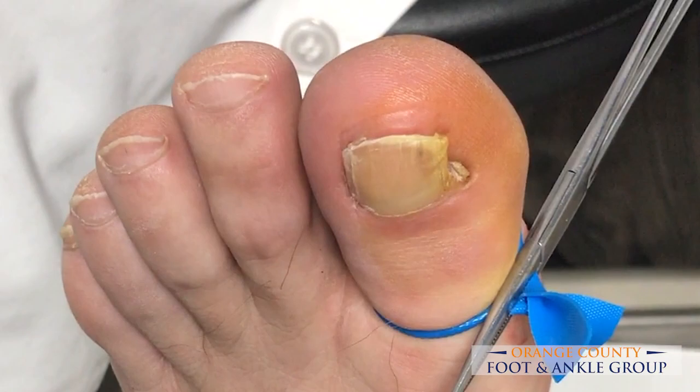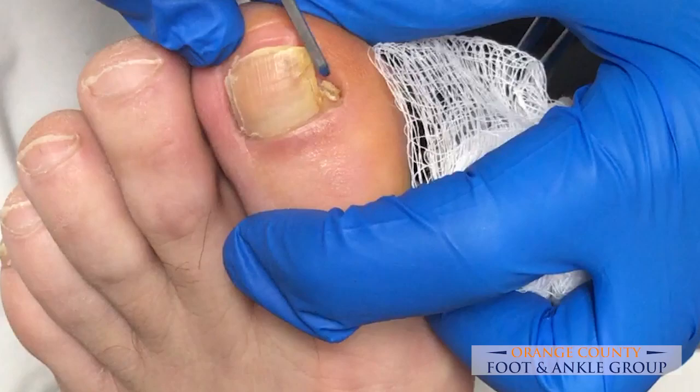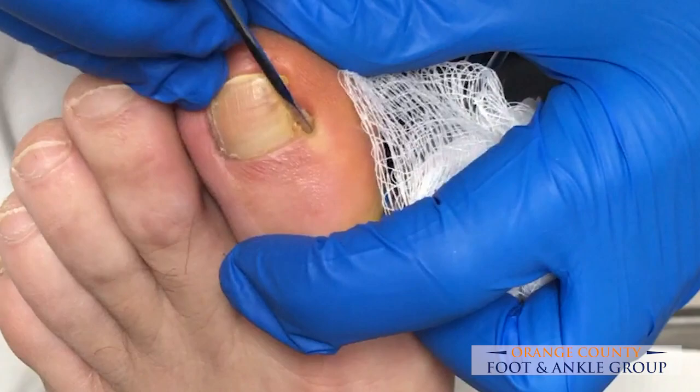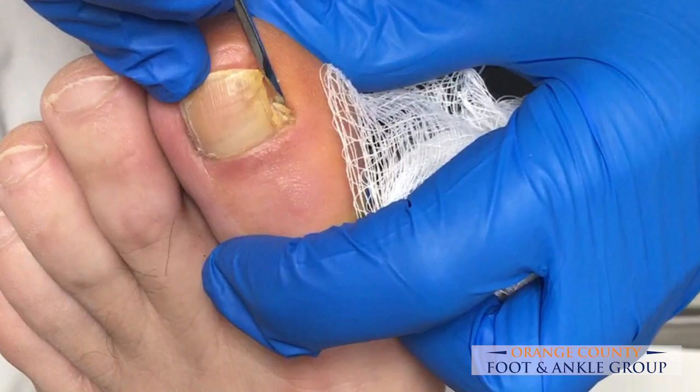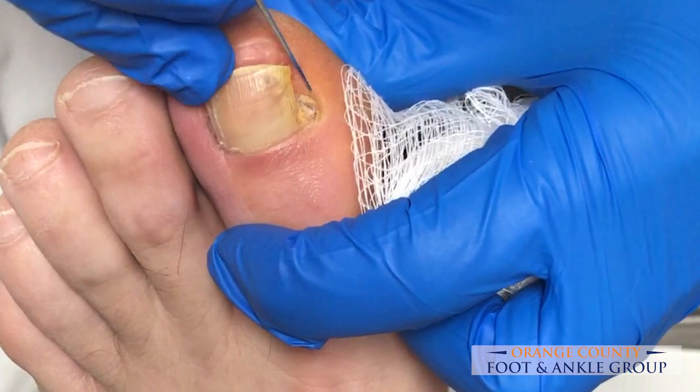We've already prepped him with a little bit of betadine. Now we're going to take our freer and we're going to kind of free around this nail spicule. He's nice and numb — he got 5 cc's of 1% lidocaine plain — so our patient doesn't feel any pain, but he'll feel a little bit of pressure as we get in here and loosen up the nail.